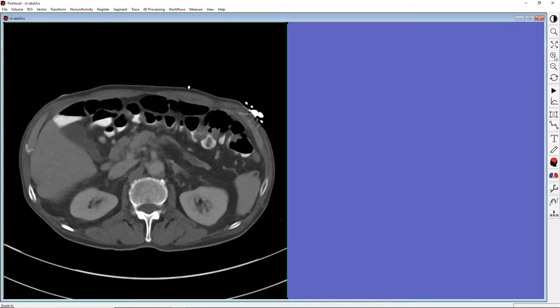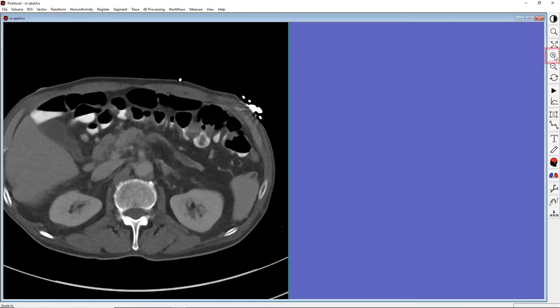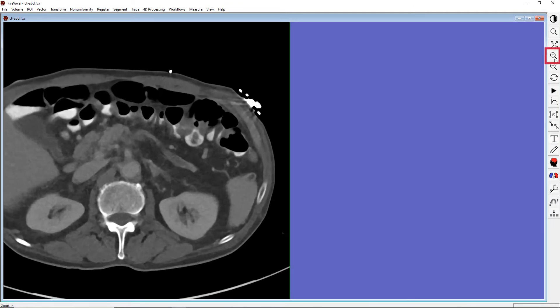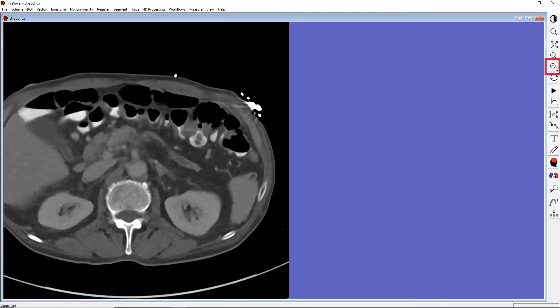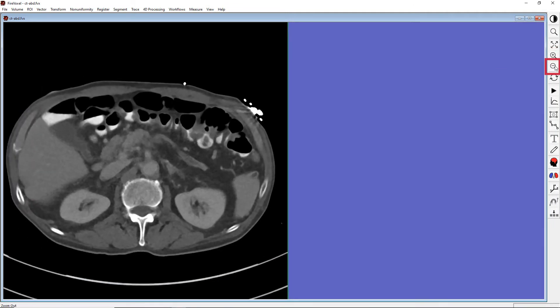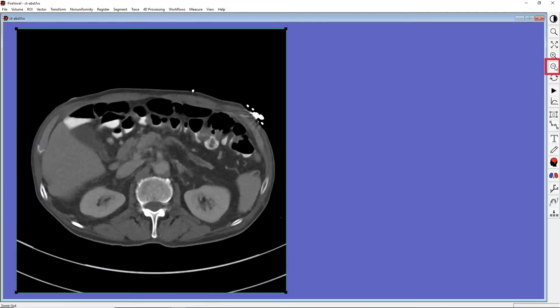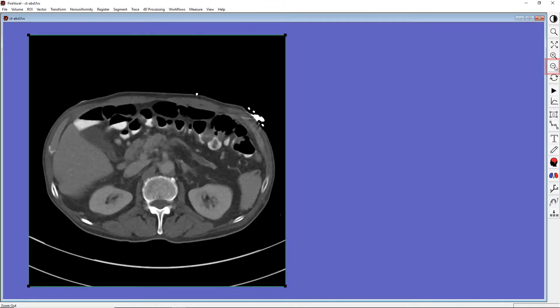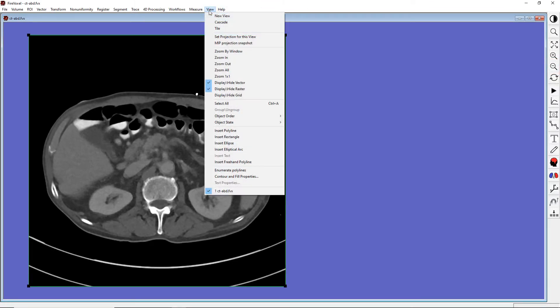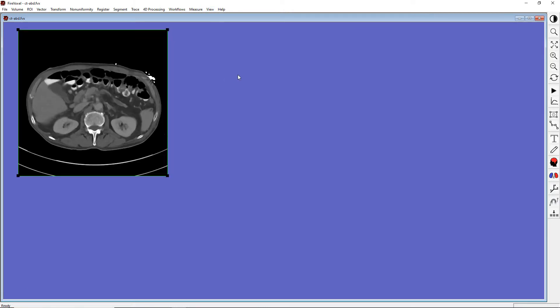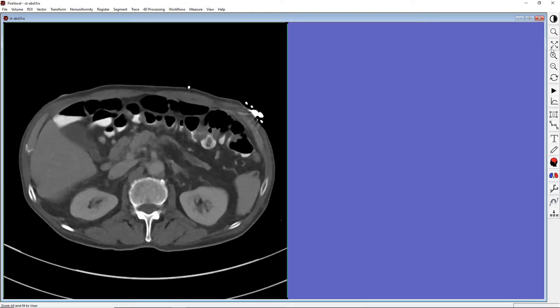The next pair of tools is Zoom In and Zoom Out that magnify or shrink the entire image. The last option is Zoom One to One. It's available through the View menu and allows you to display each image voxel as one screen pixel. Again, to restore the original view, click Zoom All.